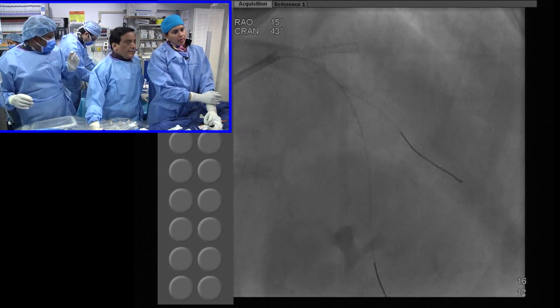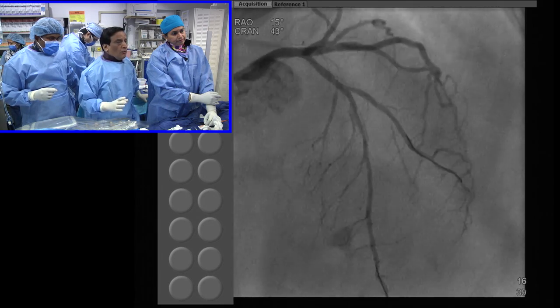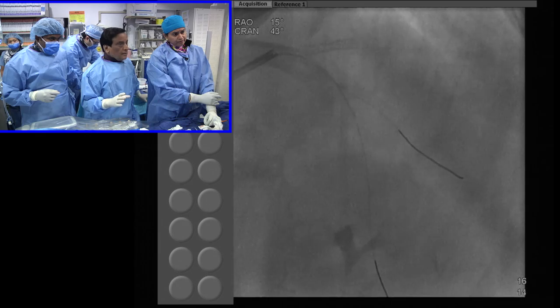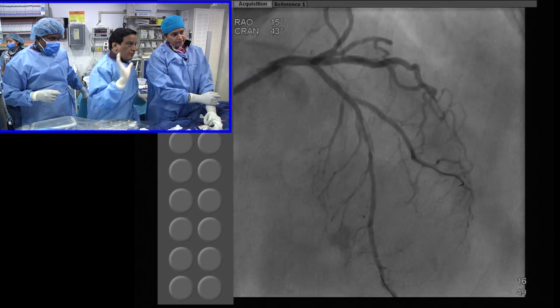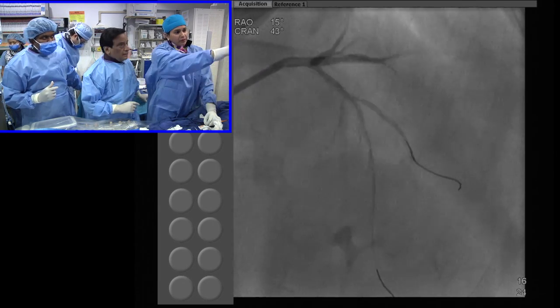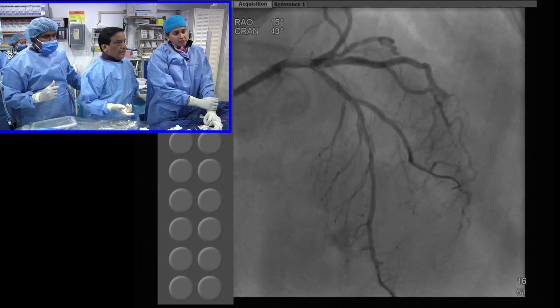So one is that we put a BVS stent in the distal vessel. Usually we try to do it if there is an issue about overlap. So here I would say safely we can put a 2.5 28 after the bifurcation lesion, coming right up to the bifurcation. Remember there is up to the septal, there is a dissection. You can take a 2.5 28 without any problem. And then we do our kissing with the 2 stent technique. The 28 will cover the bifurcation and come from the first septal up to the third septal. Okay, so good.